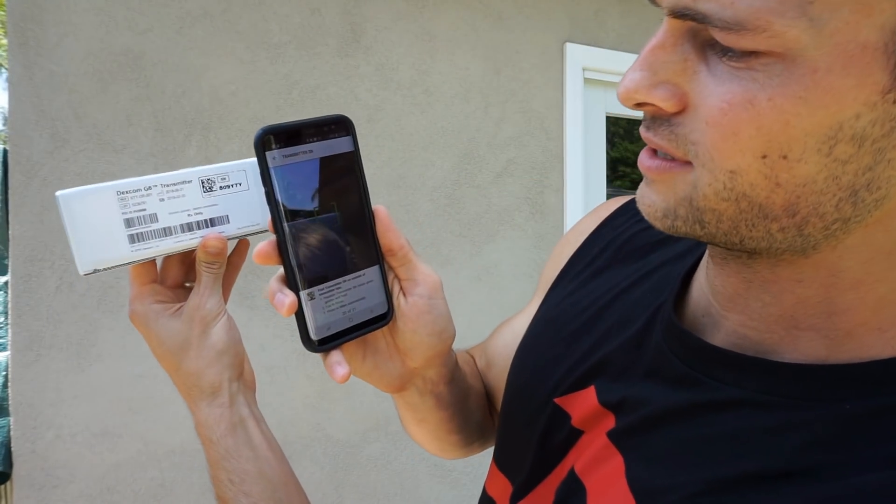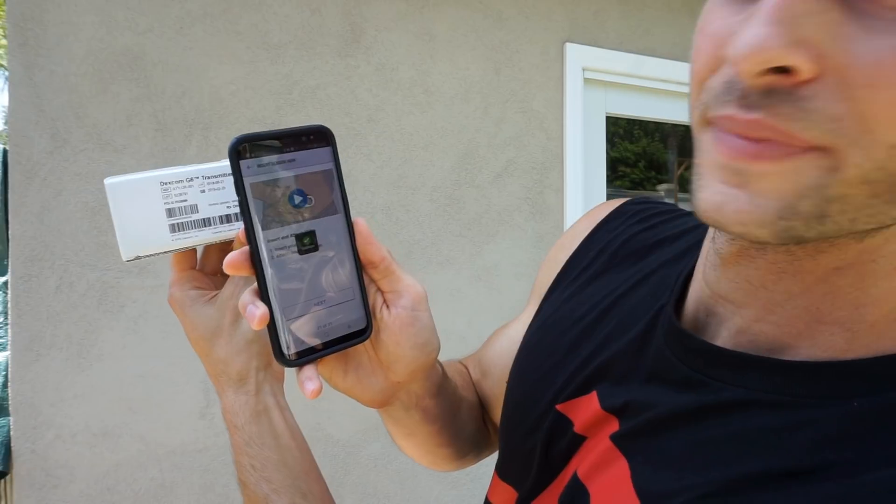The transmitter number is going to be on the back — it is going to be the one with the square-y things. So the SN number, I am going to enter — well let's take a photo, let's try that one out. See if you guys can see this — got that on screen too. They have videos throughout the setup where you can go through and watch how to do it, or you can watch me tell you how to do it and do it myself — it is way cooler. So we are going to say insert your sensor and attach your transmitter. Next — insert sensor now.